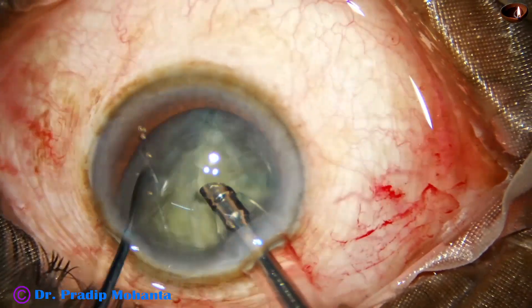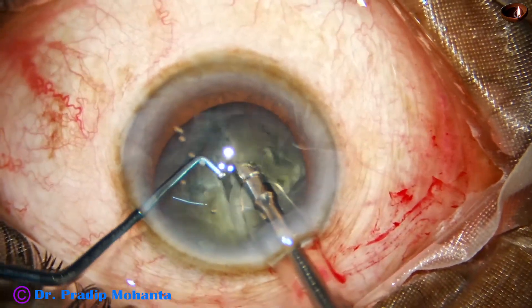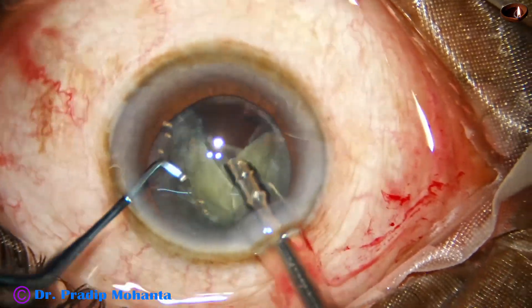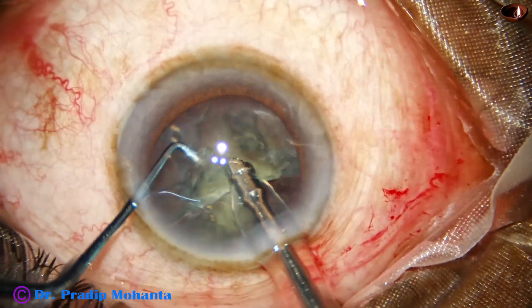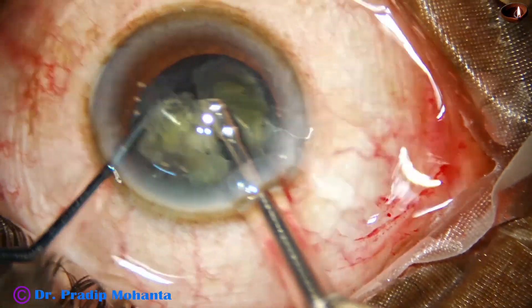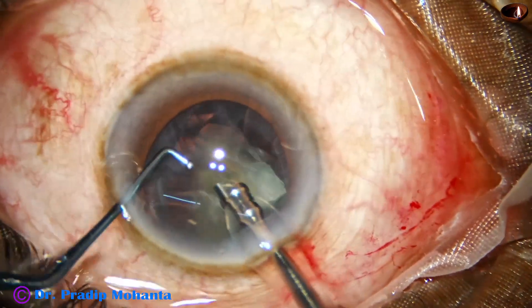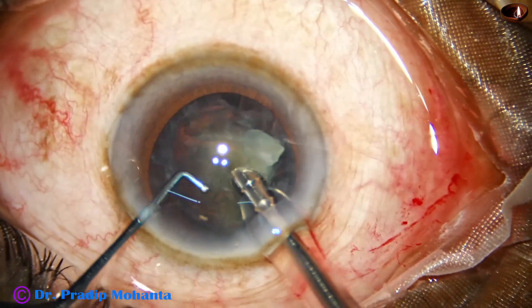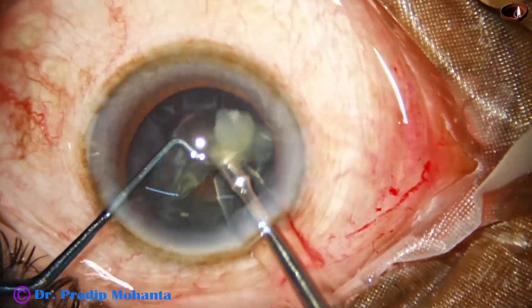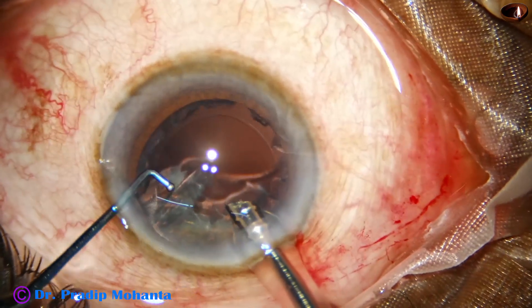Now I start managing the nucleus. One nuclear fragment is removed, then I come to the other hemi nucleus. It is divided into two pieces, one piece is removed and then the other piece. Finally, as I try to emulsify the final piece and divide it into two pieces — there is the rent.